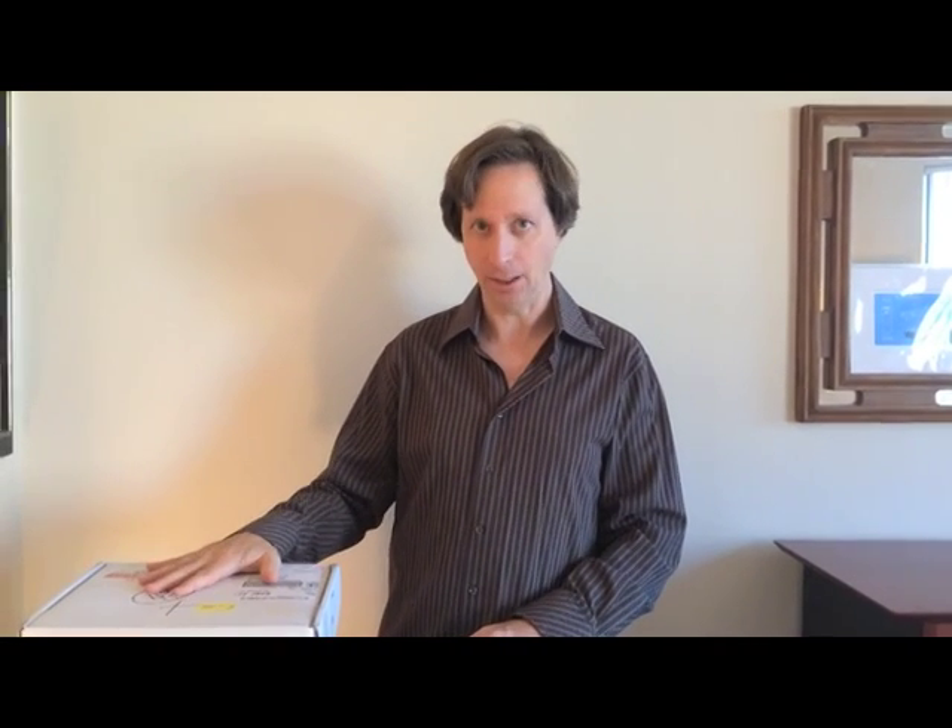We've got a shipment from Medical Guardian today, and they have just state-of-the-art equipment. Today we're going to look at two different units. The first one is a cellular-based unit where you don't need a cell phone or a phone line or anything — it has basically a cell system built into it.